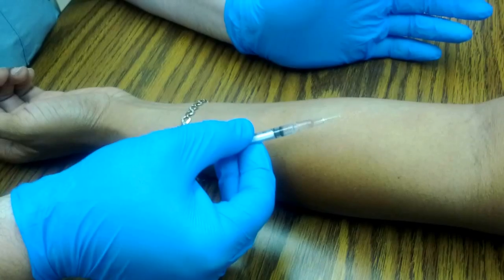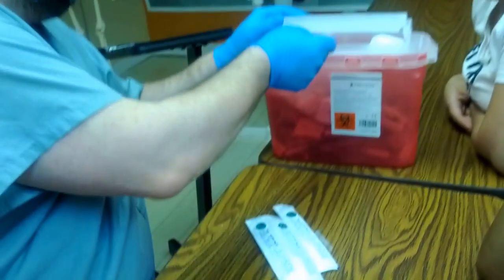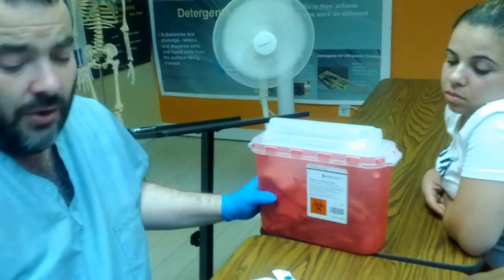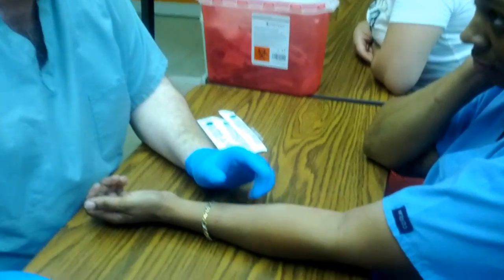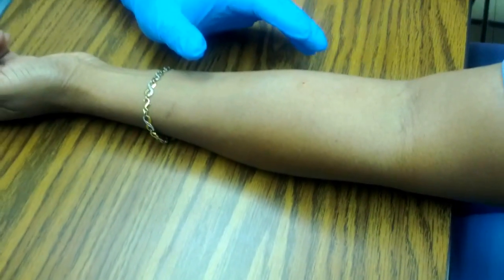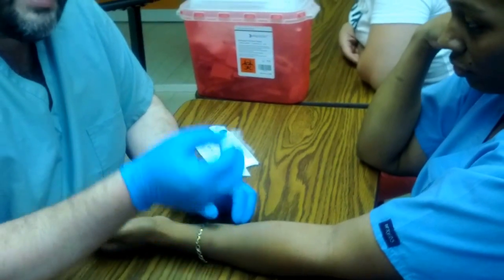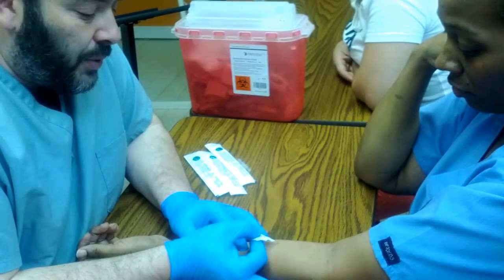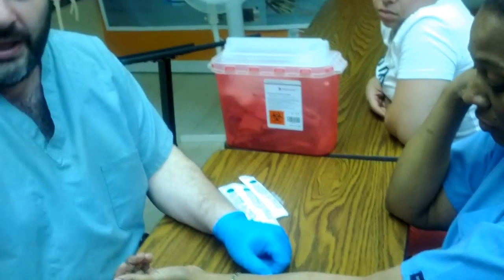Then I'm going to take the syringe out just like so, and without any further delay, put it into our sharps container just like this. Never put your hands inside — just close it and you're in good shape. We do not apply any gauze or any band-aids over this. However, if you do have a little bit of blood, sometimes it's a good idea to take your alcohol wipe and just put the corner of it right there to gently soak up the blood.